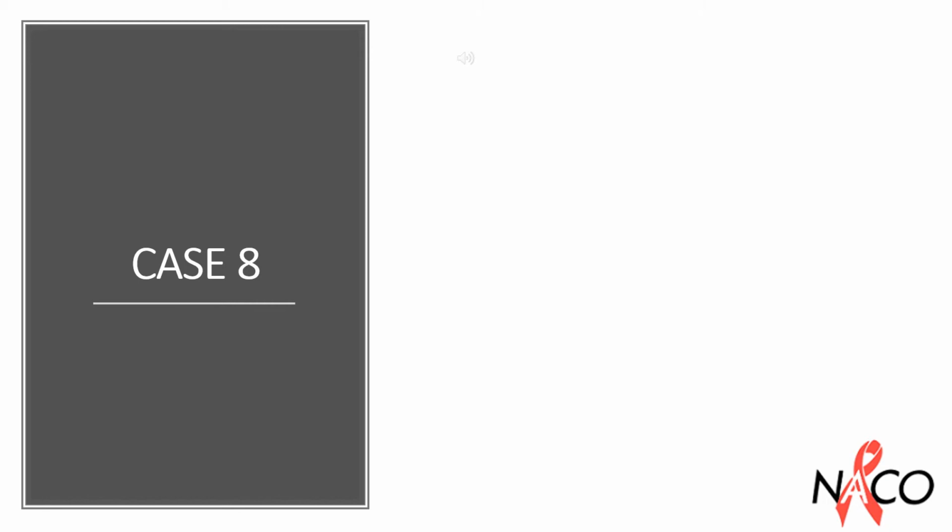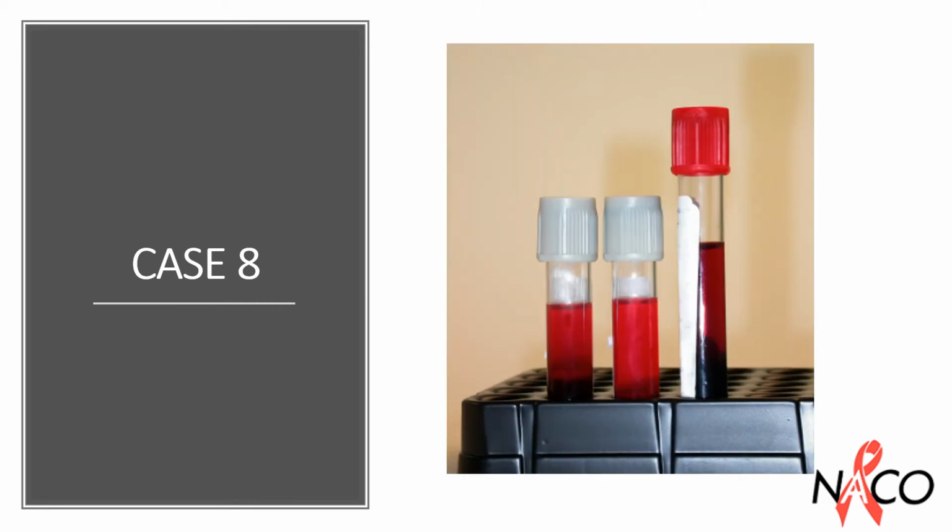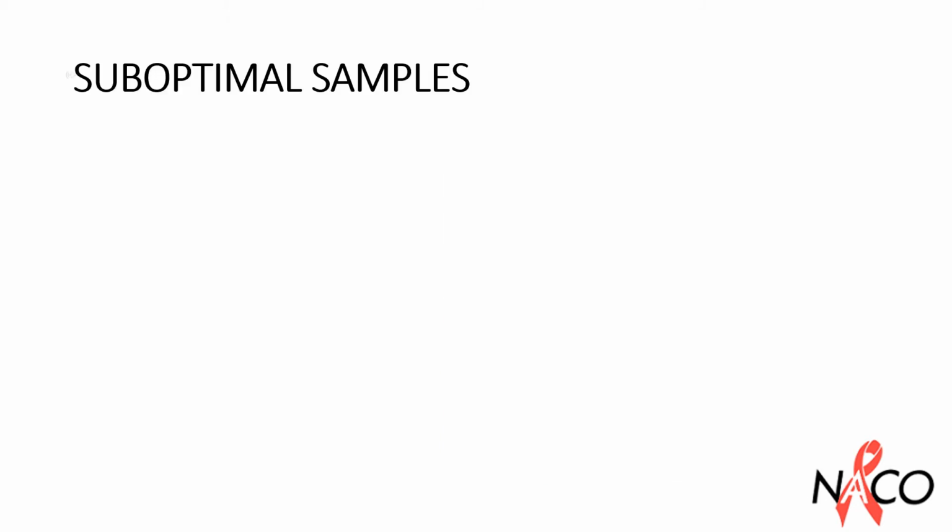Now consider a case where the laboratory has received a specimen of blood for performing complete blood counts in a patient. The specimen on examination is found to be grossly hemolyzed. What needs to be done in a case like this? A hemolyzed sample is a suboptimal sample. Suboptimal samples refer to all samples that do not conform to the standards for quality testing.